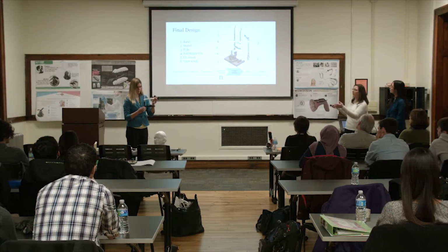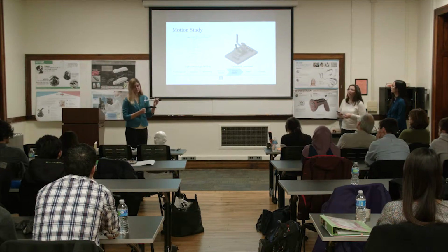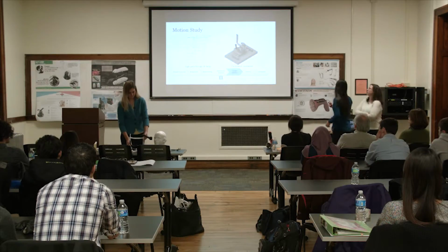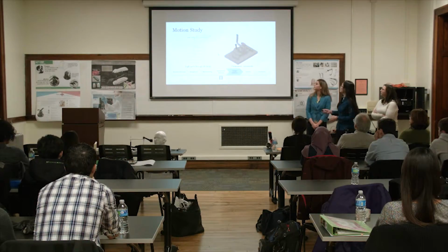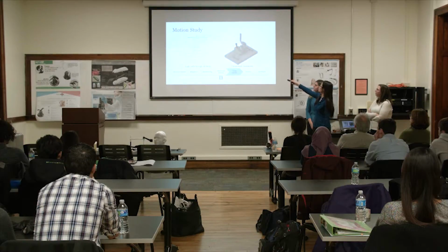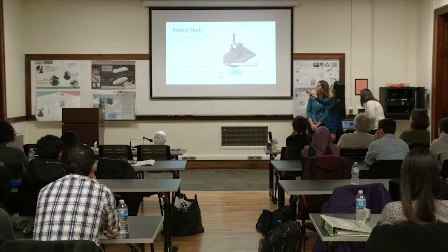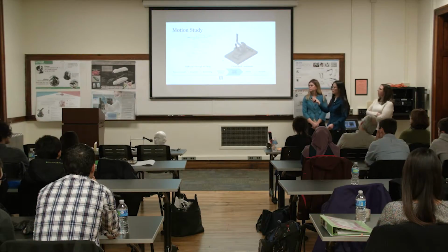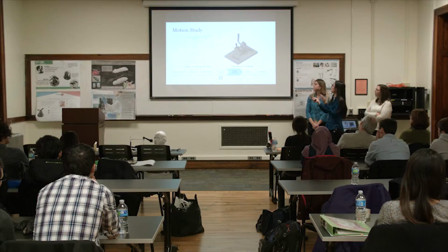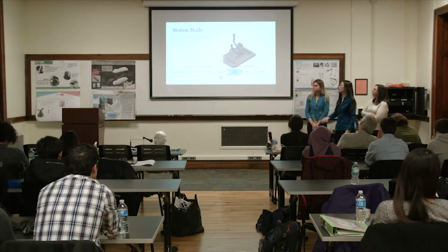Those are the different parts of it, but they're all 3D printed, and it actually works. The chin rest will move up and down with the little turn knob mechanism. If you look at the motion study, the base component can move left to right and front and back. The one here that is attached to the microscope can rotate from -90 to 90 degrees, so the doctor can see different sides of the eyes, and then that's basically the X, Y, and Z movement.